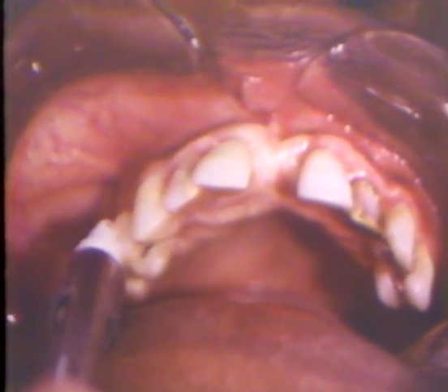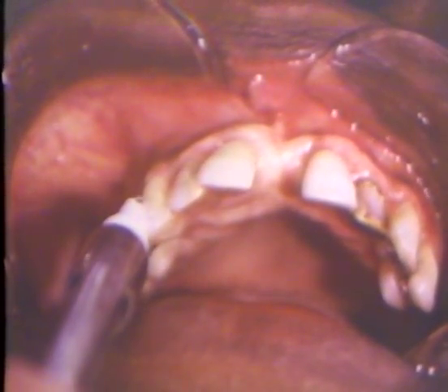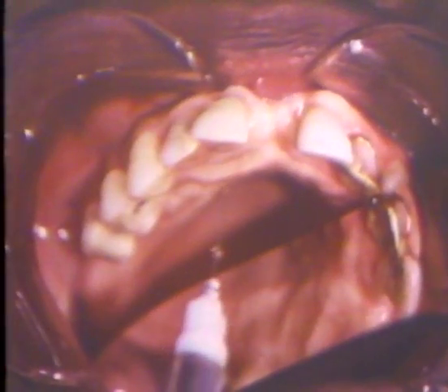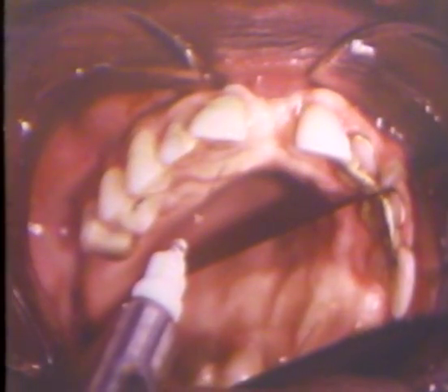A deep pocket exists between the first and second maxillary premolars. Its surgical elimination will be demonstrated. The topical anesthetic has been applied. A local anesthetic is infiltrated in the buccal and labial areas. It is also injected in the palatal tissue, infiltrating from the central incisor to the second premolar.